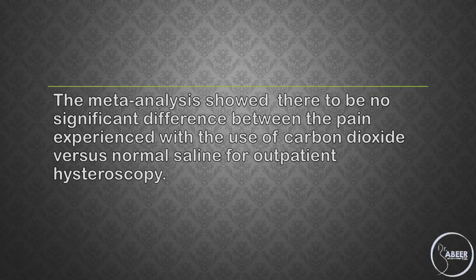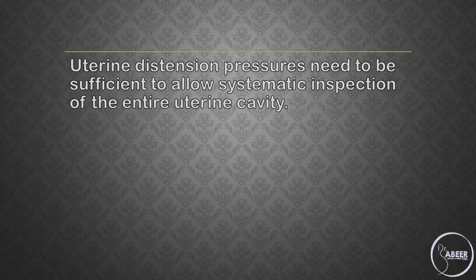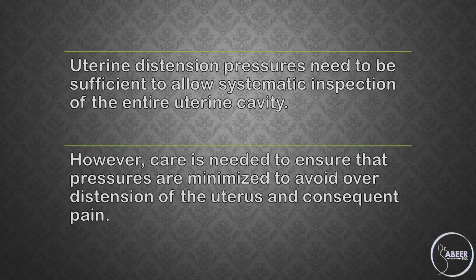The meta-analysis showed there to be no significant difference between the pain experience with the use of carbon dioxide versus normal saline for outpatient hysteroscopy. Uterine distension pressures need to be sufficient to allow systematic inspection of the entire uterine cavity. However, care is needed to ensure that pressures are minimized to avoid overdistension of the uterus and consequent pain.